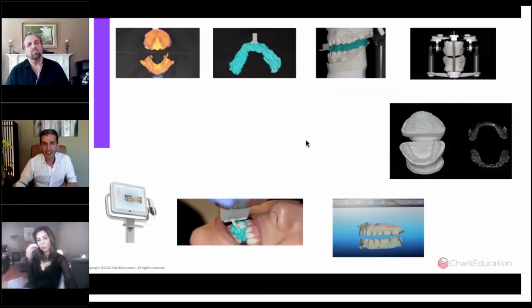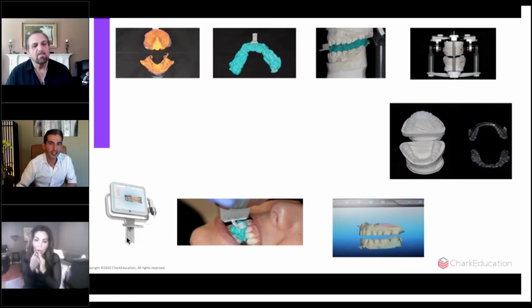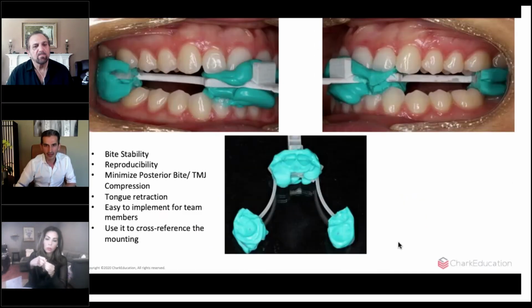So here is the result. This is what we did. As I said, top line, we had the PVS, fully adjustable articulator; the digital arm, scanning. We did the digital workflow scanning. I'm going to show you. We use the digital bite fork, and we send these STL files to the manufacturer. Why did we use the digital bite fork as opposed to a normal George gauge, right?